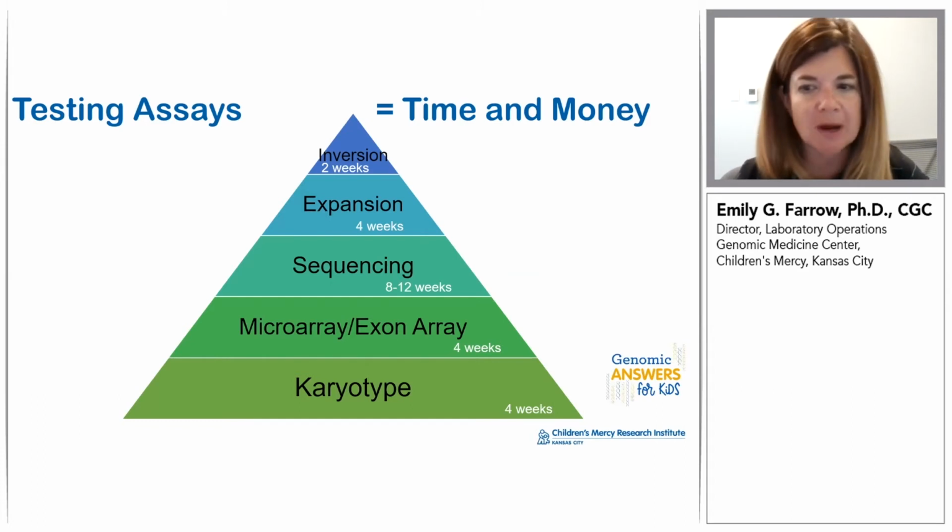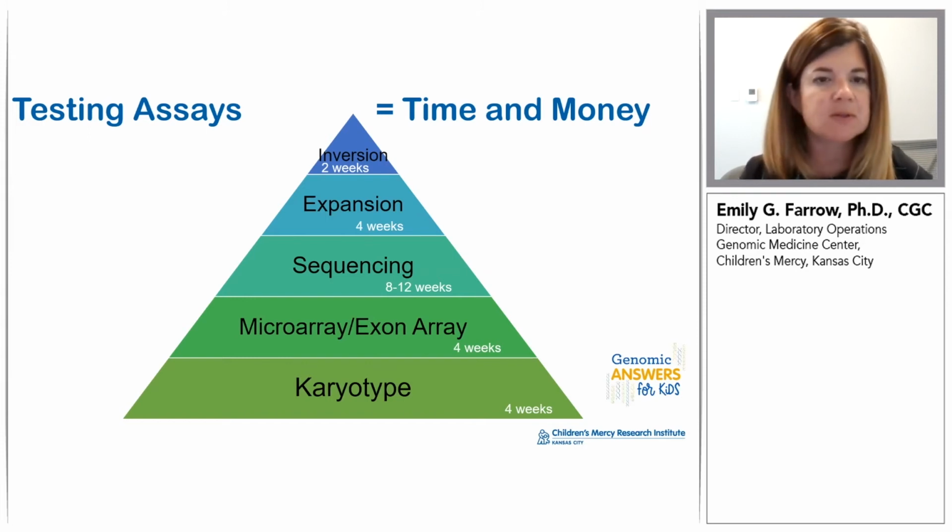Now, the addition of copy number variant detection from short-read exome and genome sequencing does allow for some testing to begin to be condensed. However, again, these tests cannot detect expansion disorders. Informatic algorithms for PCR-free genome sequencing can screen for known expansions. However, these are still a screening mechanism that requires orthogonal confirmation.